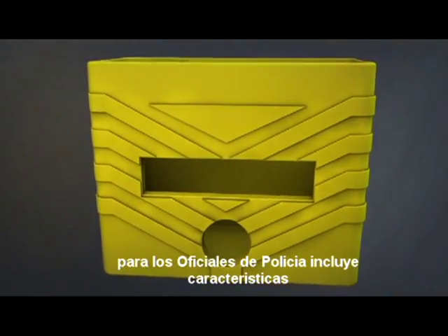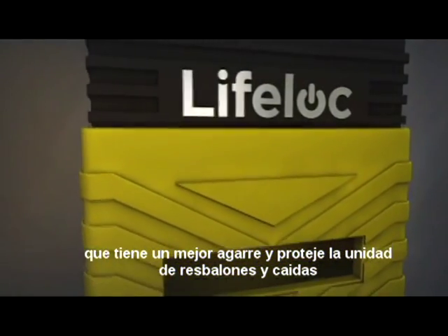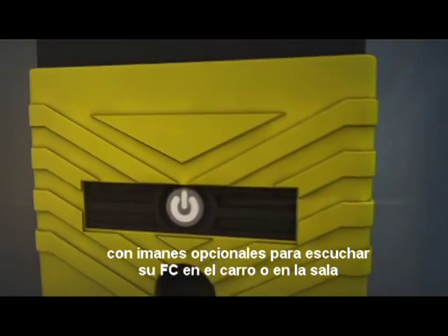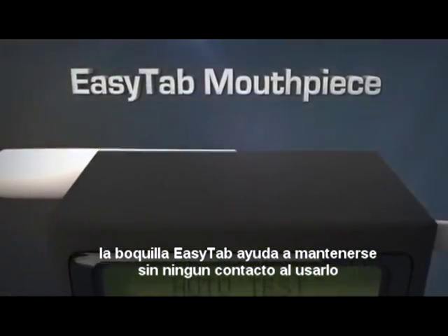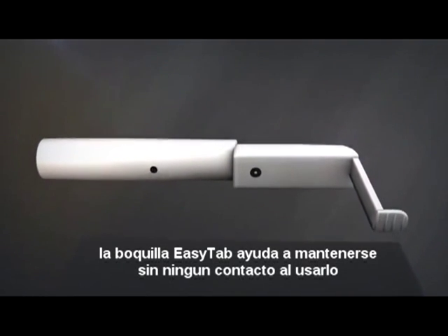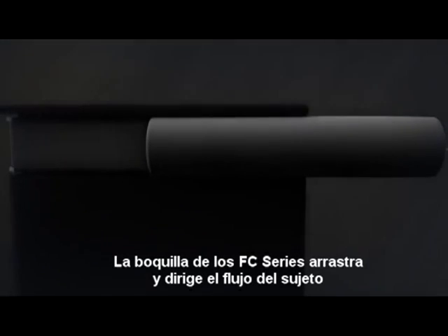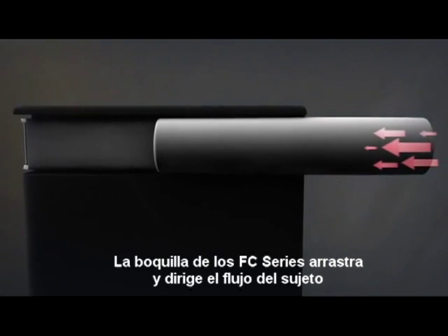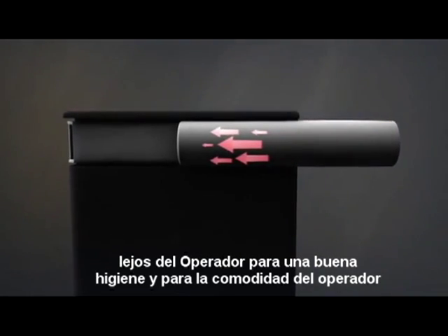Officer safety features include a protective grip keeping your unit safe from slips and falls, with optional magnets to adhere your FC to the car hood or trunk. The easy tab ensures no contact with the wet end of the mouthpiece, keeping you away from germs and mess. The FC Series mouthpiece directs the subject's breath flow away from the operator for good hygiene and operator comfort.